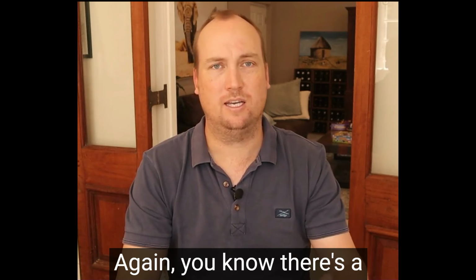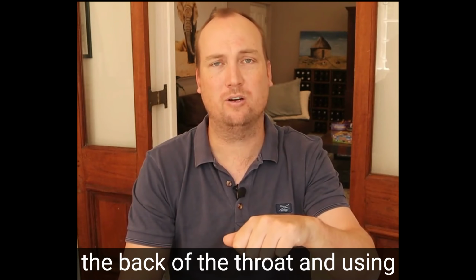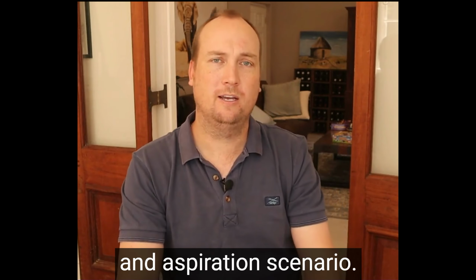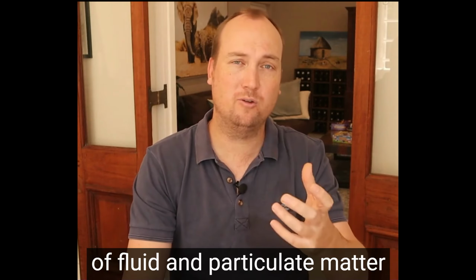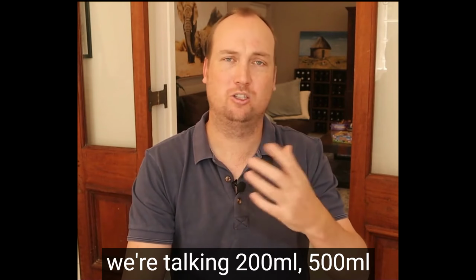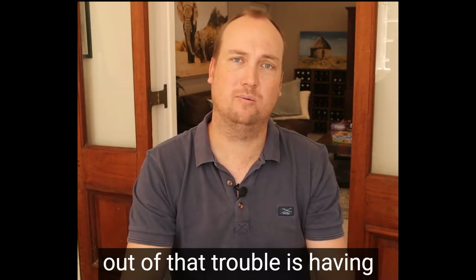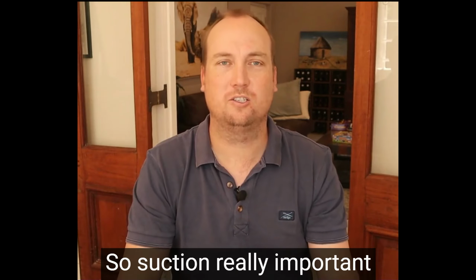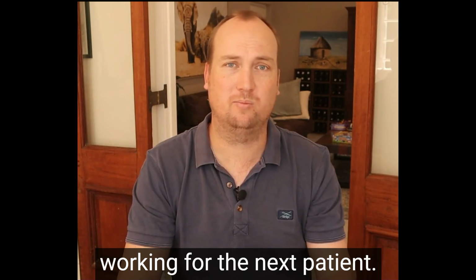And again, there's a difference between using your suction if there's a bit of secretions or a bit of blood in the back of the throat, and using your suction for a vomiting and aspiration scenario. I've had patients vomit on induction or vomit on emergence, and the amount of fluid and particulate matter that comes out is large. We're not talking 10 mils, we're talking 200 mils, 500 mils of fluid that comes out. And when that happens, the only thing that's going to get you out of that trouble is having suction that is working perfectly, and every second counts. So suction, really important, and really important to check it between cases that it's still working for the next patient.